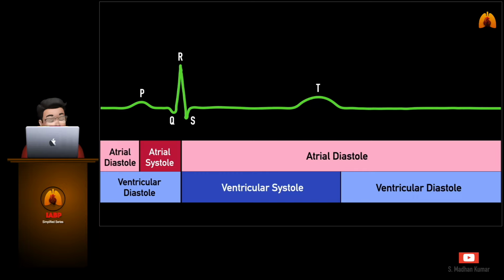The ST segment refers to the gap between the S wave and the T wave and represents the time between ventricular depolarization and repolarization. An elevated ST segment is the classic indicator for myocardial infarctions, though missing or downward sloping ST segments may indicate myocardial ischemia.